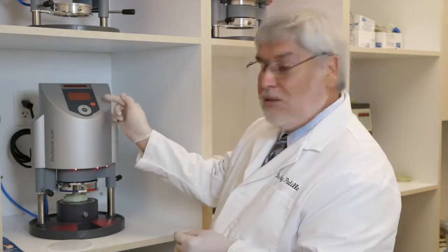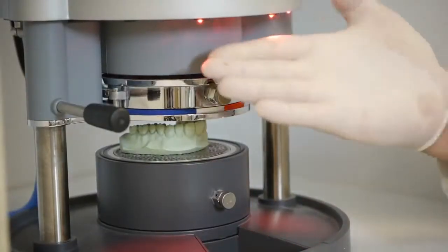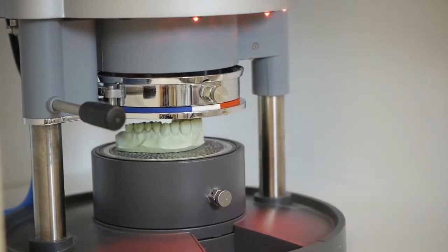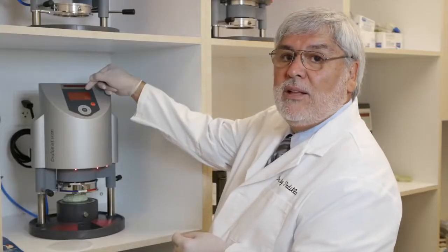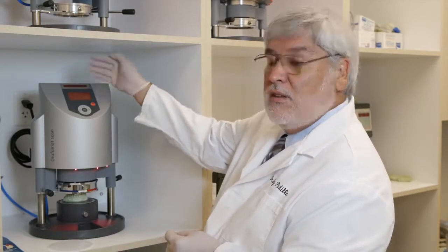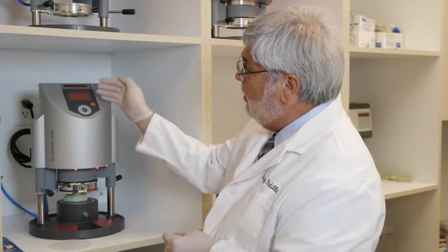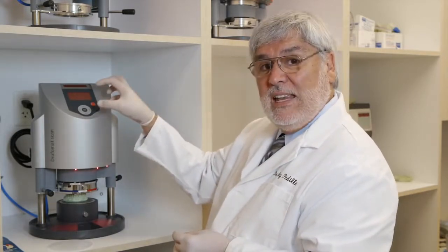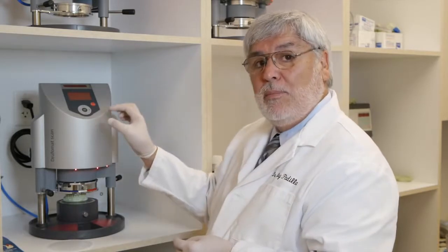Pressed OK. That starts the process. The lights are on. So the heating element has just turned on. Now it's starting to count down. It started at 1:50. Now it's down to 1:36. So it's counting down. Once this counts down to the preformed heating time, you will hear a beep.